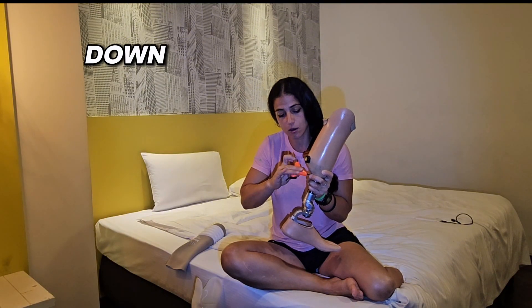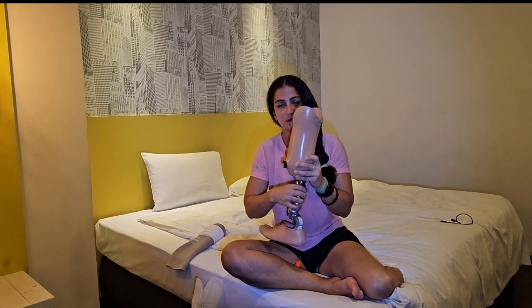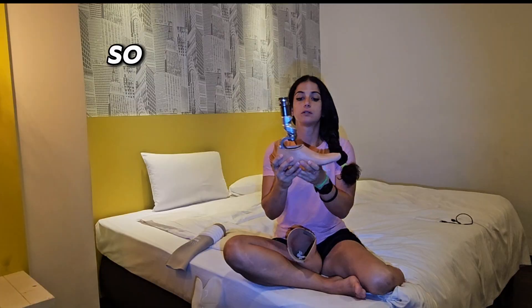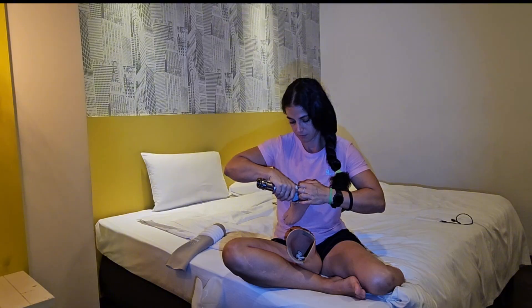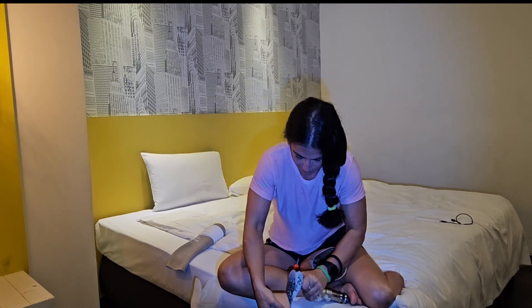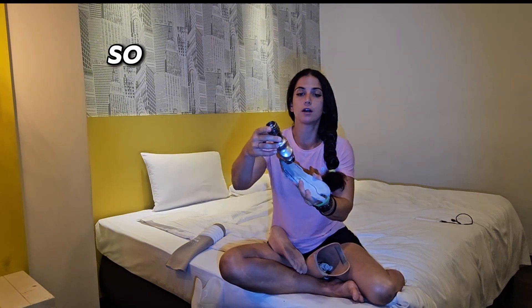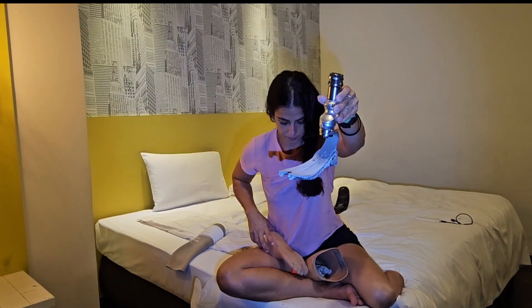This is a socket. I'm going to break the whole leg down into two parts. Now we have a socket and the other foot. This is the bottom foot and it has a foot shell — I'll show you what's inside. Here it is — there's still some sand on it — this is how the balance foot looks inside the foot shell.